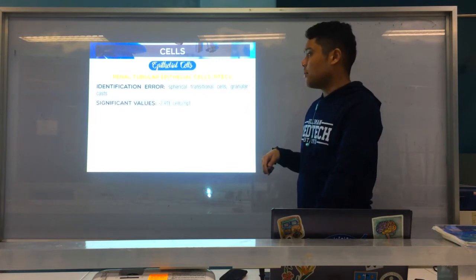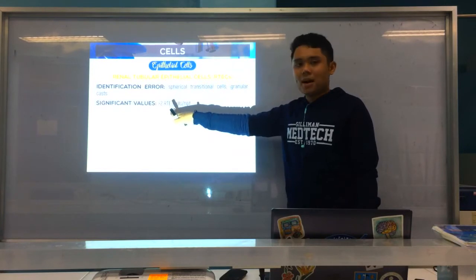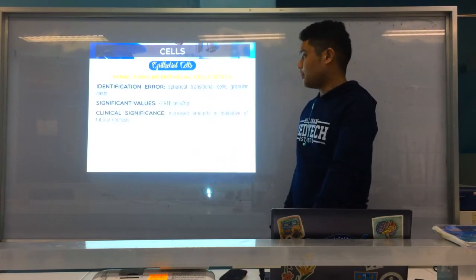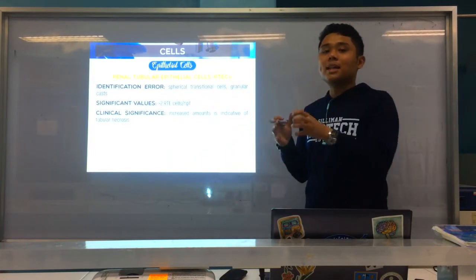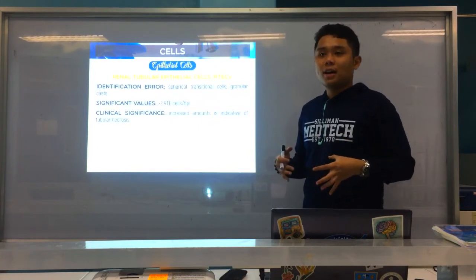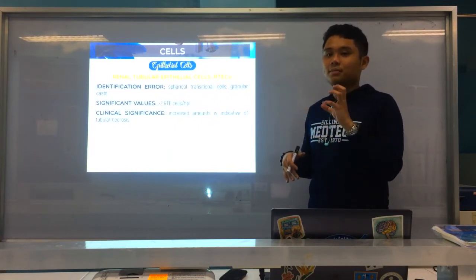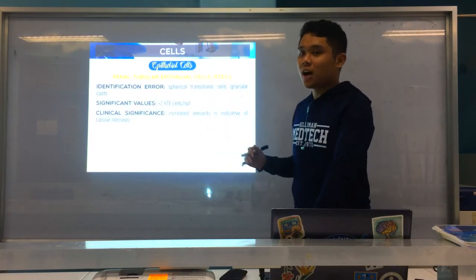Okay? Alright. So, significant values greater than 2 pa lang, di ba? Imagine na inanara kagamay, di ba? Greater than 2, minimum ra of 2, significant na siya. Because again, gikan siya sa tubules. Increased amounts because again, indicative of tubular necrosis, meaning ang tubules nimo nangamatay na ang cells. So because of necrosis na ni-express na ang cells of the tubules mismo kay gina-release na sa ihi or na-appeal na sa ihi because again, your tubules are dying, the cells are dying. Or because of tubular necrosis. Munang significant yun ang RTE.